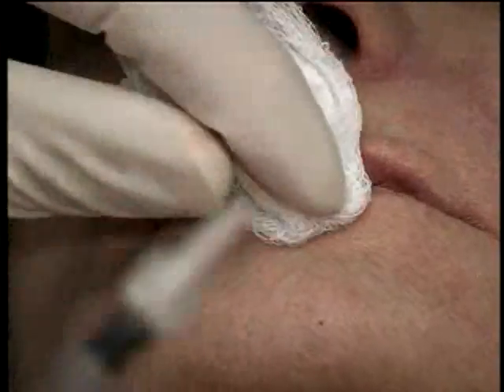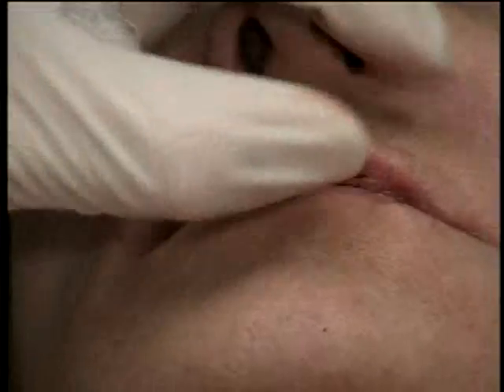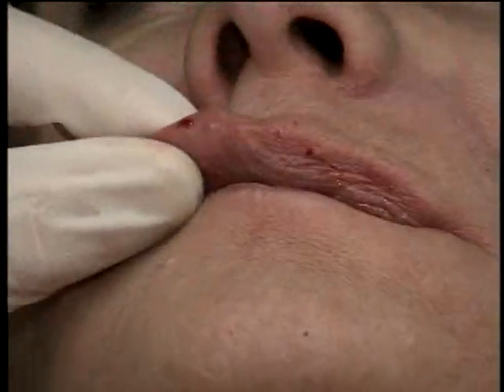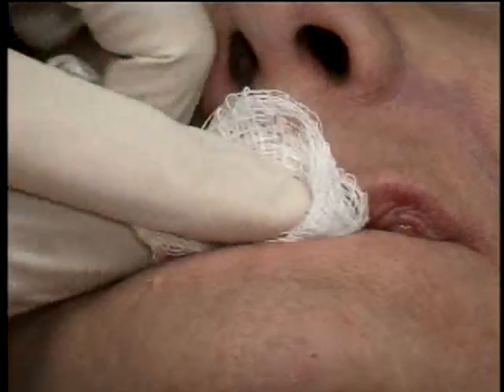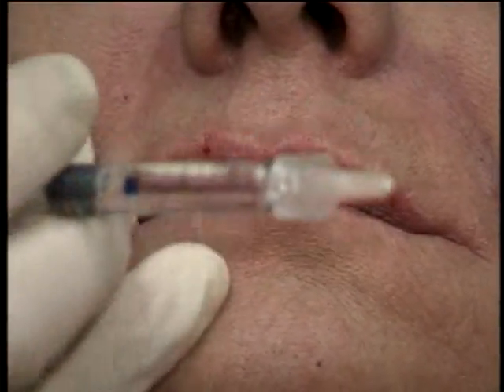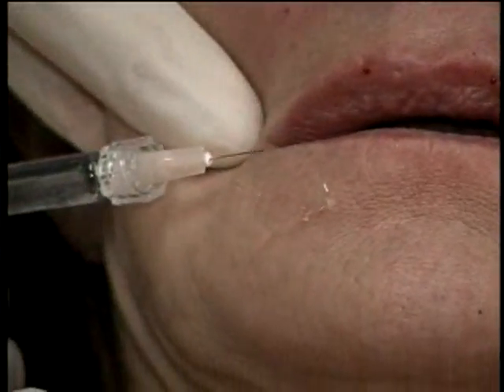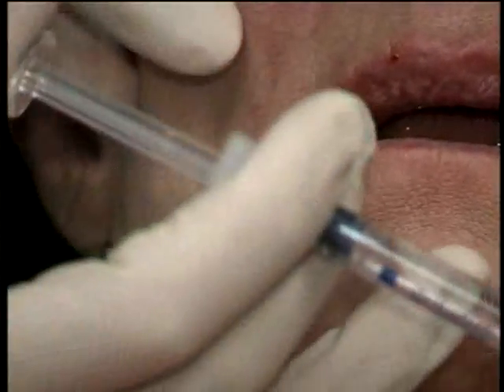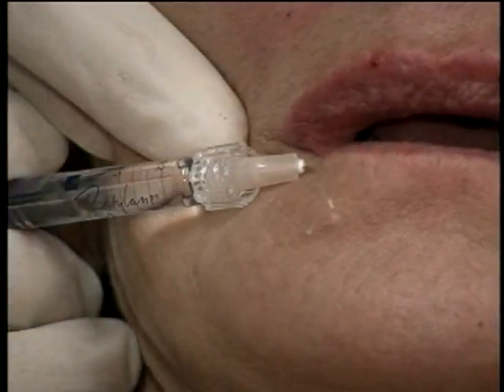See another vial, please. You can palpate where you put it to make sure you didn't miss. That feels pretty nice. Okay, now we're going to do the lower lip. So put your lip out like this. She doesn't feel her lips. So I retract the lip, so I'm on retraction here. And once again, into the lip border.